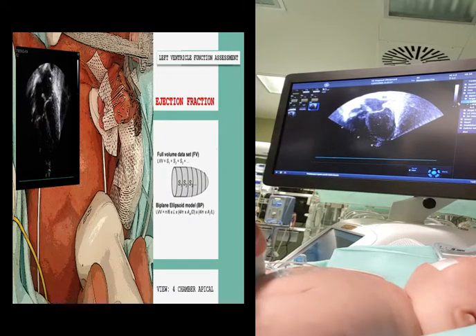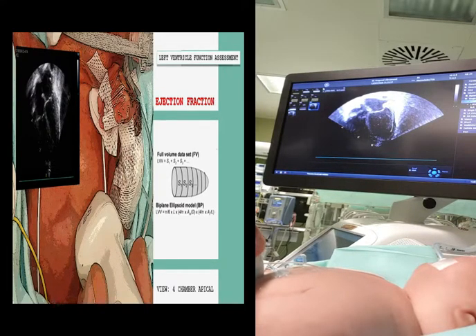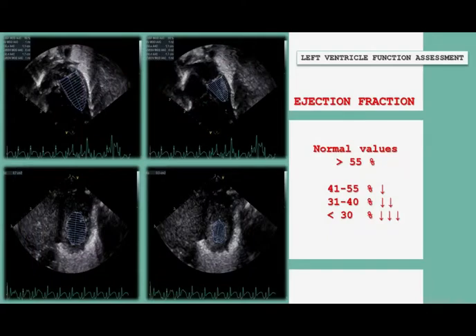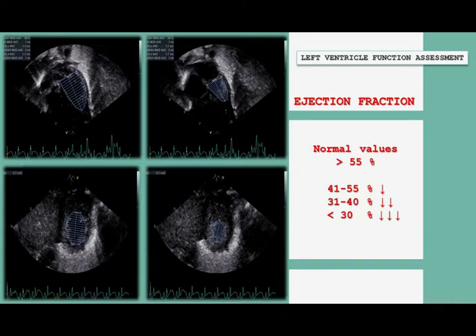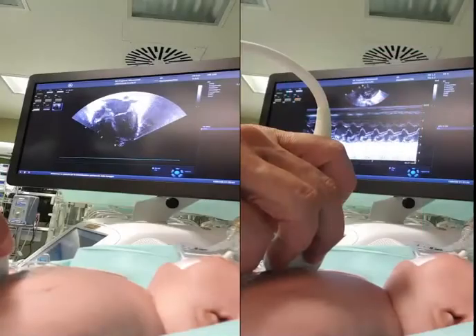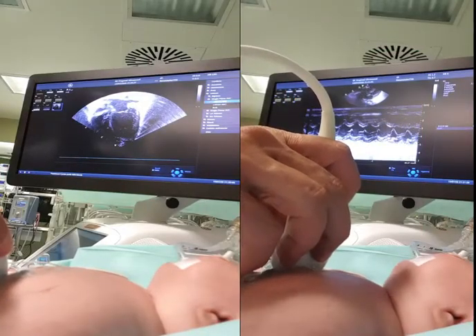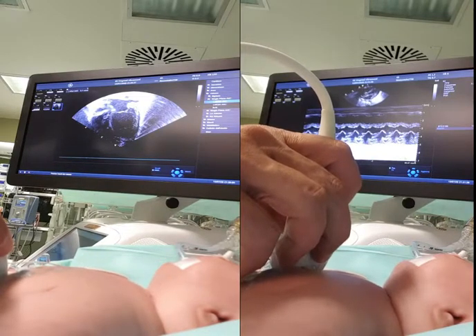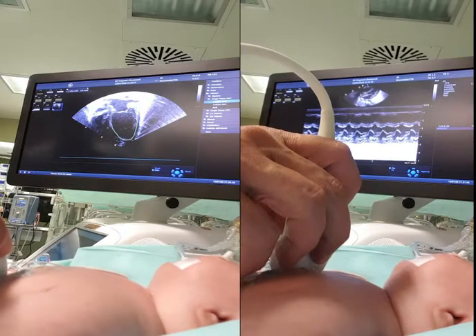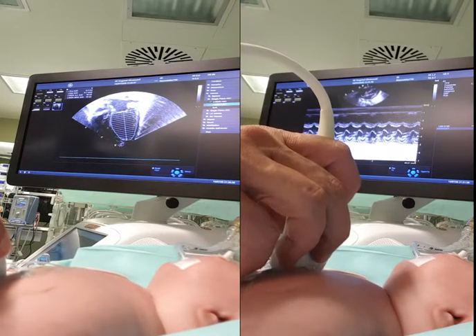Relative tachycardia and non-elliptical left ventricle shape may give inaccurate measurements. Despite these limitations, ejection fraction is preferred over fractional shortening as it accounts for regional wall motion abnormalities. The accepted normal value for ejection fraction in the newborn is greater than 55%. Lower values are consistent with slight impairment between 41 and 55%, moderate impairment between 31 and 40%, and marked impairment below 30% of left ventricle function. The image acquisition for assessment of fractional shortening and ejection fraction is rapid and easy, and the calculations are simple and easily reproducible, making them good bedside echocardiographic parameters for use in emergency situations and in routine clinical practice.